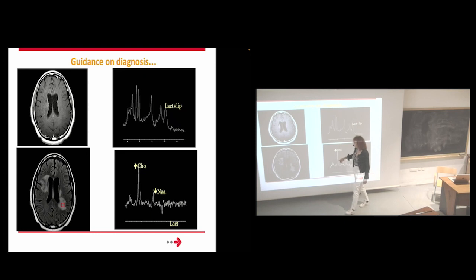And here you have a tumor. And if I take the metabolites choline, NAA, and lactate for this voxel in this part of the brain that corresponds to a tumor, you can see that NAA is very, very low. We can see that lactate finally disappears, it's just like noise, but you haven't a peak like this. And unfortunately, as the choline is very high, it is not a benign tumor, but a malignant tumor.